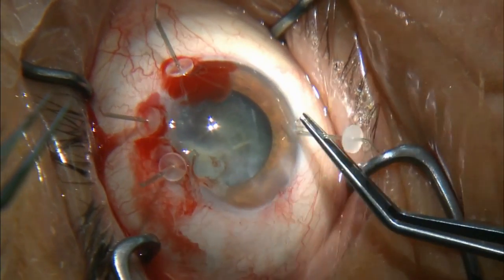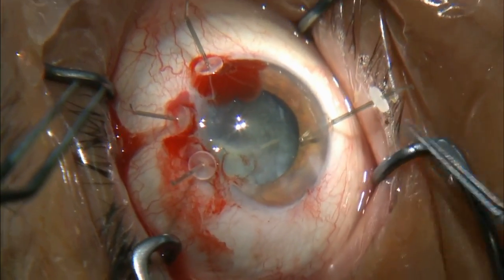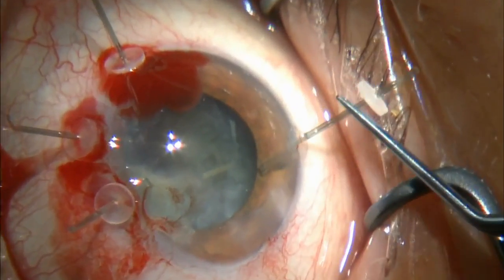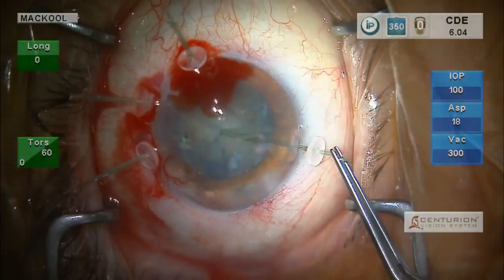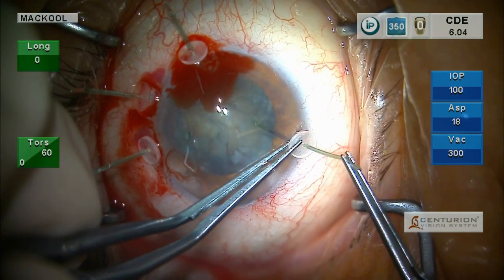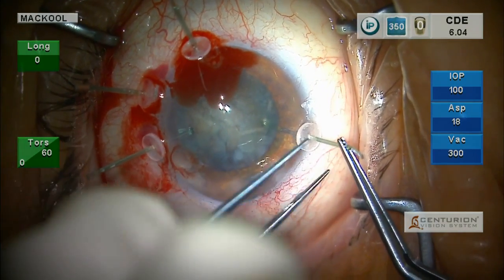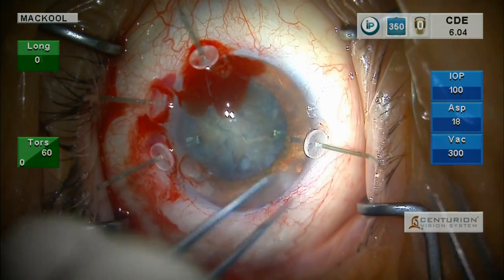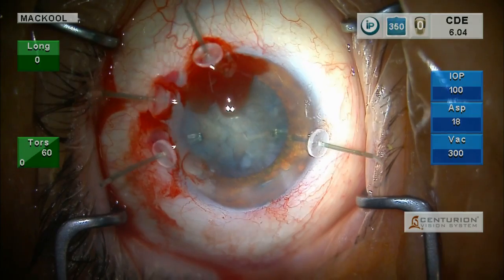Here is our opposing capsule retractor. For the rest of the procedure, you can think of these retractors as the zonule — and they are sturdy. We're good to go and we'll do some more phaco.